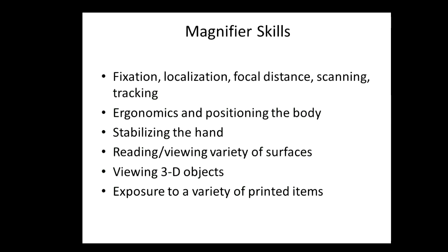You can do a lot more with a magnifier than just read a book. So challenge your student to find those objects that they want to inspect, those high interest objects. In presentation 1, we had looked at magnifier skills, and I very quickly want to review these. The fixation, localization, maintaining focal distance, scanning, and tracking, we will quickly go over.